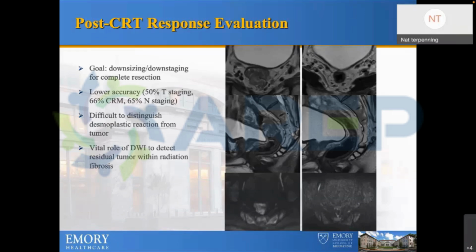Since you talk about the perpendicular plane to the tumor, it means that when you do the scout MR, if the tumor does not sit exactly perpendicular to the axial, coronal, or sagittal, you have to scan a little bit oblique coronal, oblique sagittal. Is that the way to scan it, or do we just go ahead and do axial, sagittal, coronal?